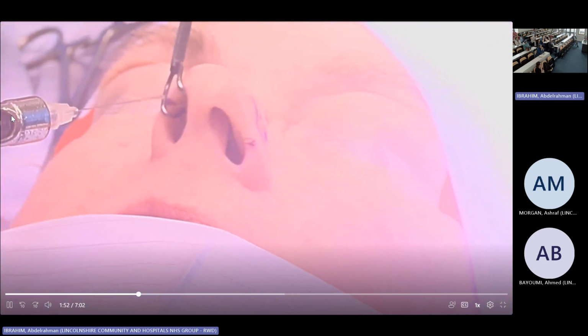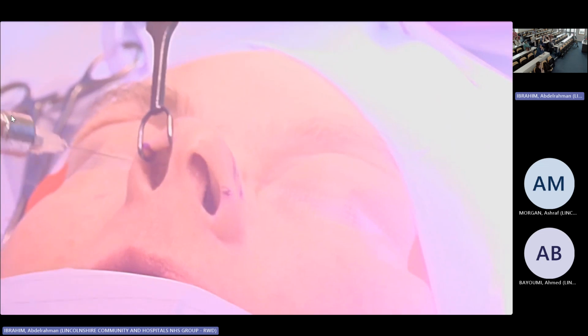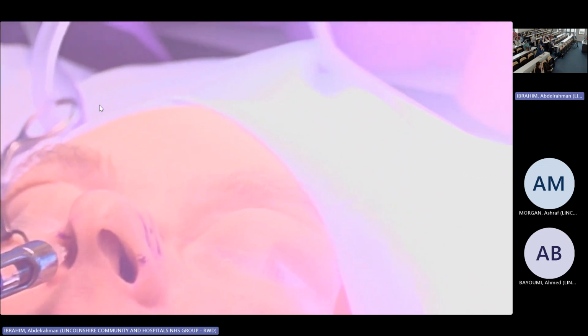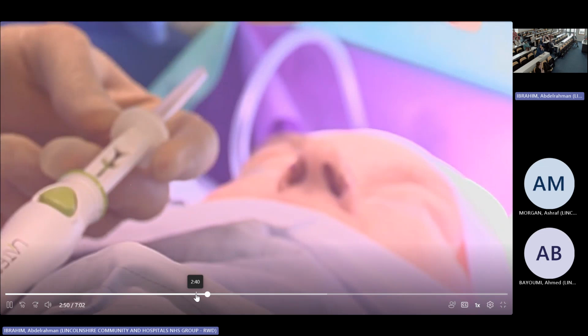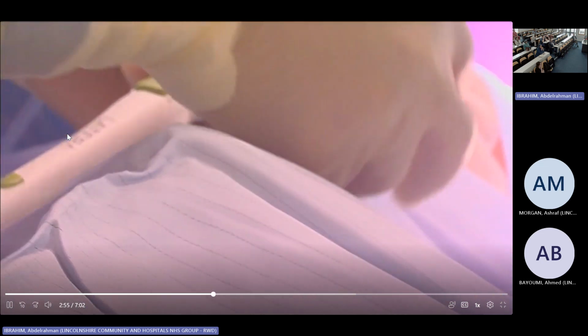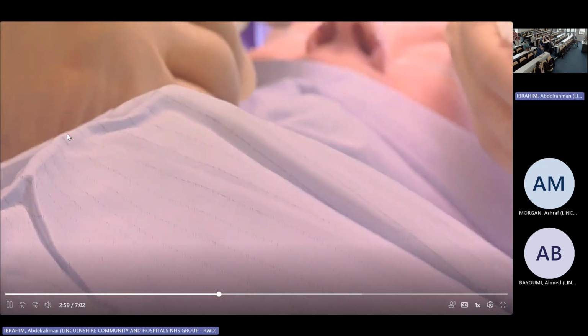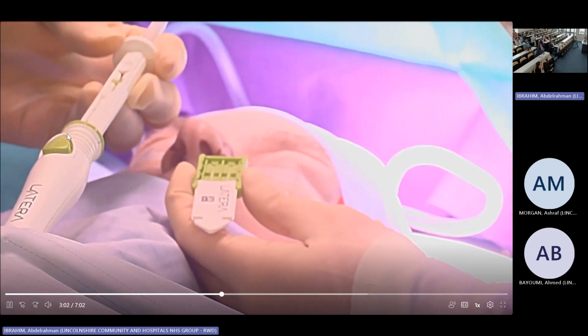That's why. So local, you just inject the area that you're going to implant in or introduce your trocar in, up to the bone, again the other side. And then this is the introducer, okay? And the way to open it and close it, we're going to practice on it anyway. And we're going to show you.